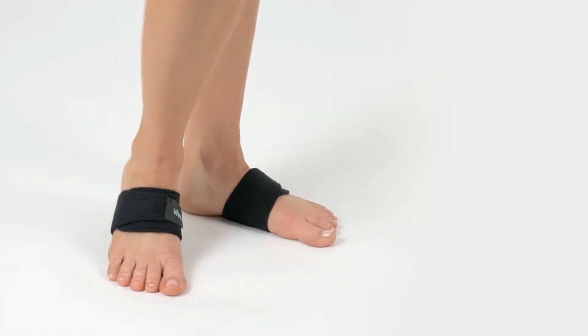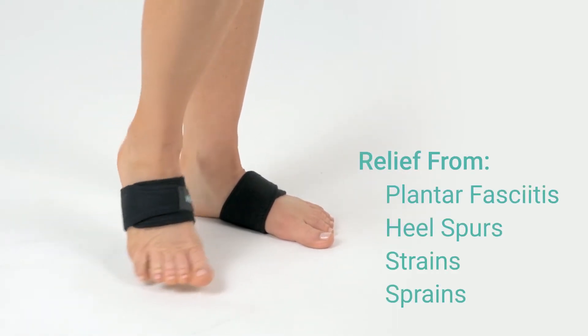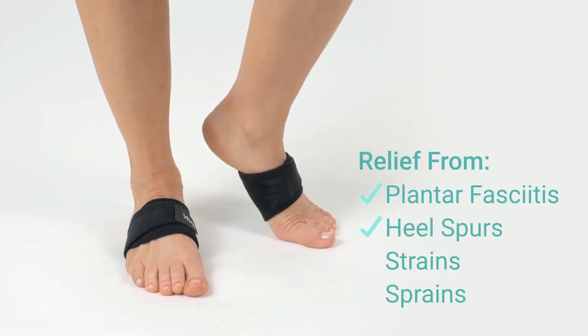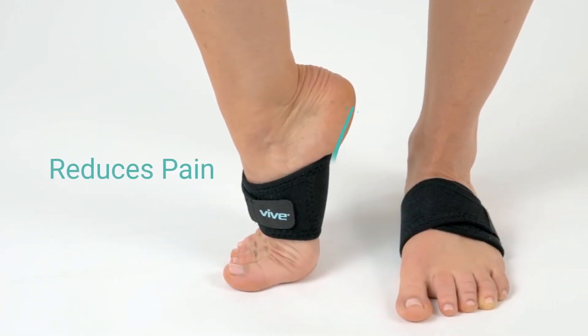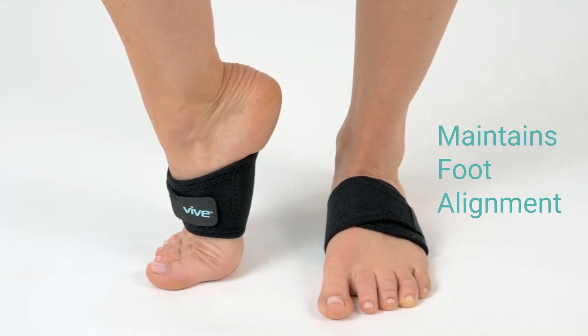The Arch Support Brace by Vive provides relief from painful foot conditions such as plantar fasciitis, heel spurs, strains, and sprains. The adjustable compression brace supports the arch and reduces pain, maintaining proper foot alignment.